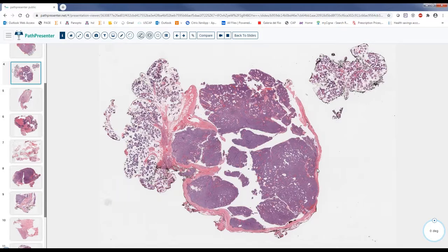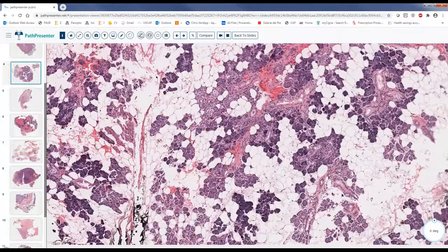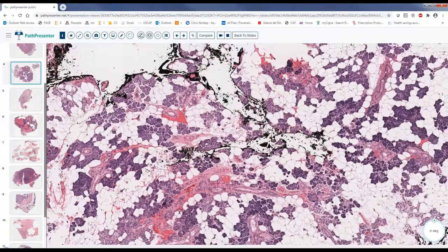Mariam, you said submandibular gland. Why is it submandibular? No, before talking about the lesion, just tell me which salivary gland. I agree with you, this is a salivary gland. I think there are two or three answers, either it is parotid or it is submandibular gland. The difference, as you know, is what type of salivary gland tissue we have here.